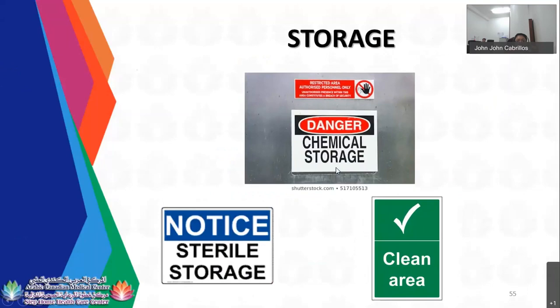So for storage in CSSD, as I discussed earlier, whatever is sterile should stay sterile, and whatever is clean should stay clean. Chemicals should be separated. Chemical storage, I mean. You cannot store chemicals with clean consumables or other consumables. They should be separated in a designated storage location for chemicals only.